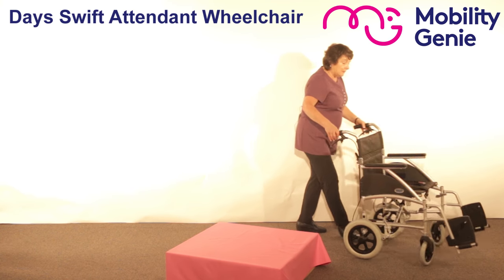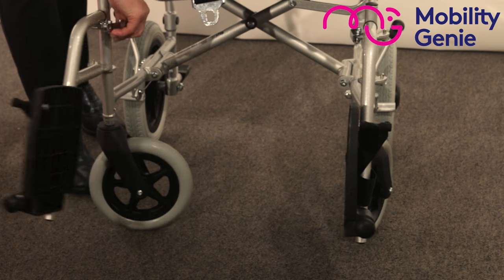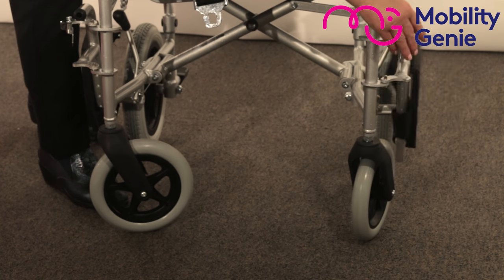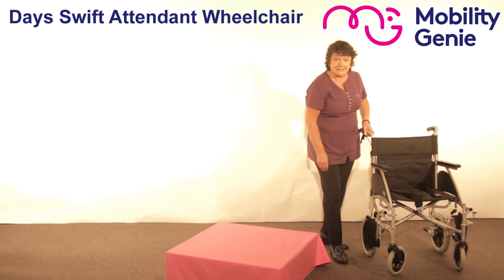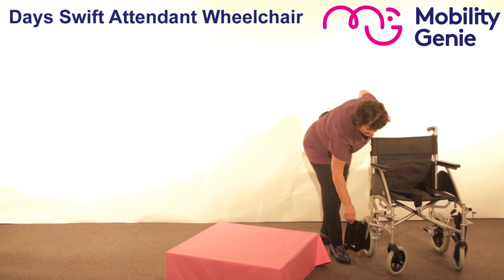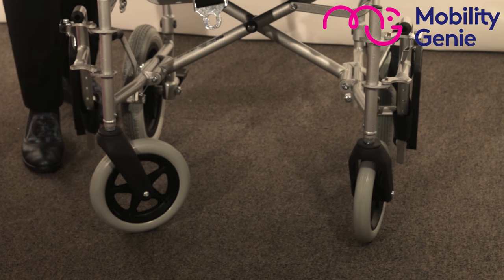Going along the front of the wheelchair, you'll see the two footrests which can be easily swung back on both sides. You must remember to do that when getting a person on and off the wheelchair, in order not to break the skin or cause harm. You always have to put on the brakes when a person is getting on and off the wheelchair.